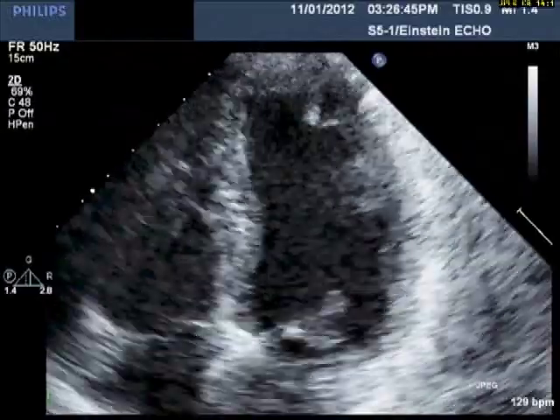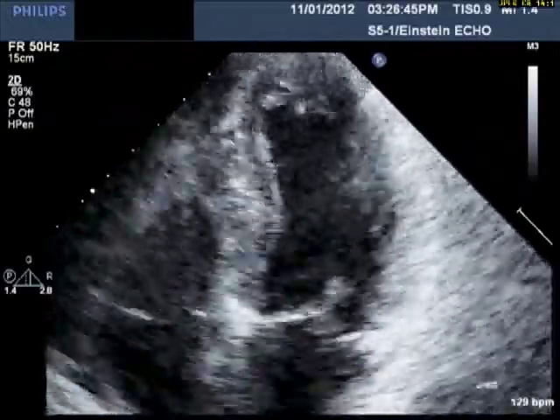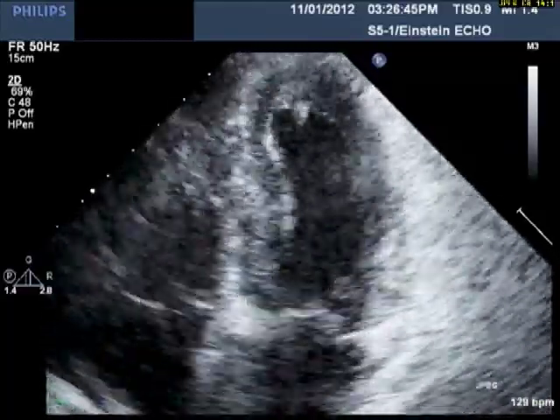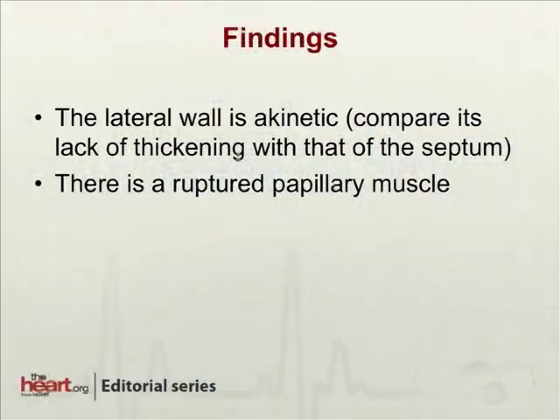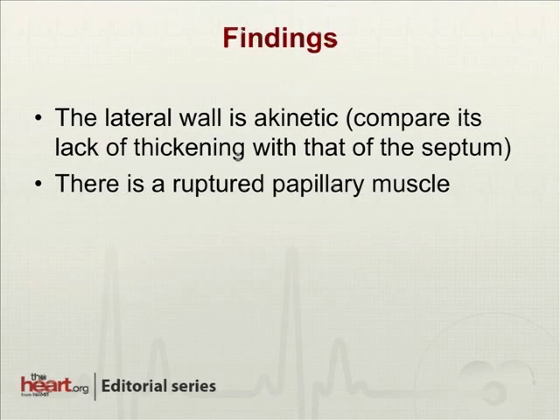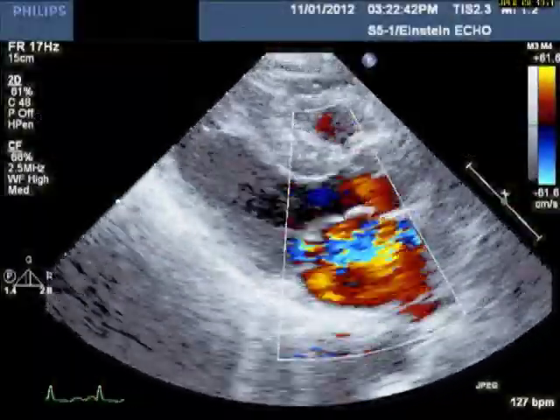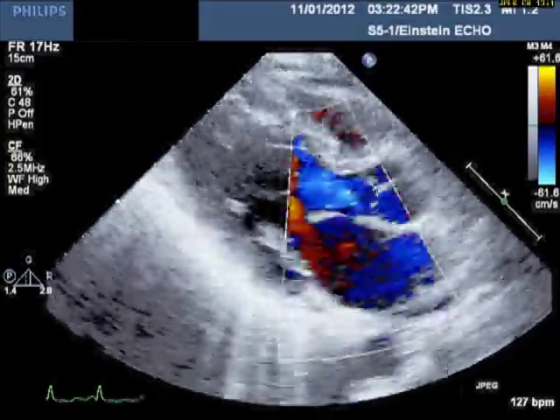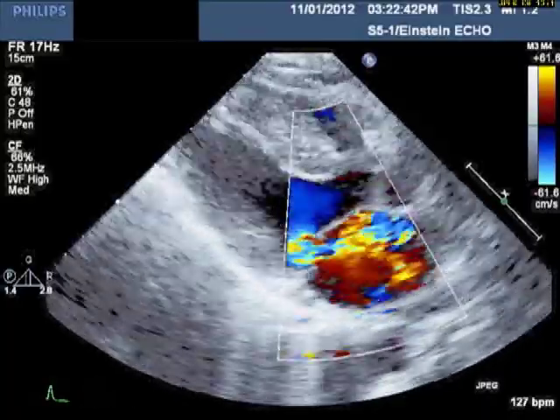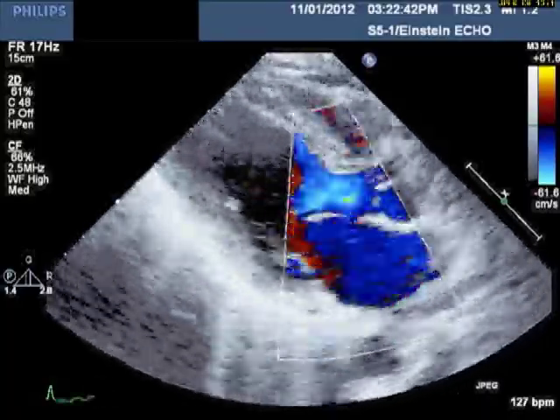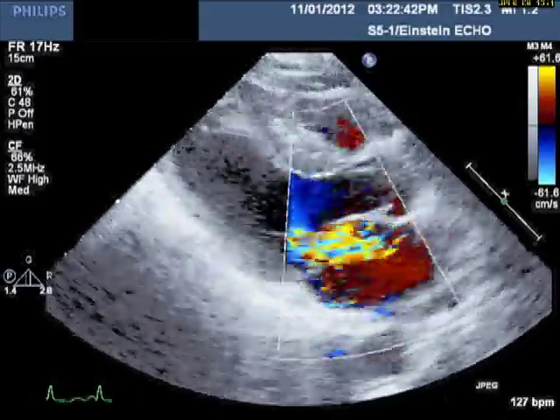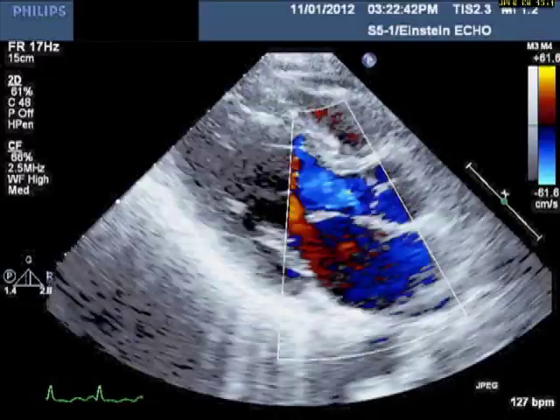So let's take a closer look. Here again in the apical four-chamber view, if one looks very closely, the lateral wall is akinetic. Compare it to the septum — the septum is thickening very well, but the lateral wall is not thickening at all. And if you look very closely, there is a ruptured papillary muscle. The next slide shows the original image with color, and you can see a flail mitral leaflet — posterior leaflet — with severe mitral regurgitation.